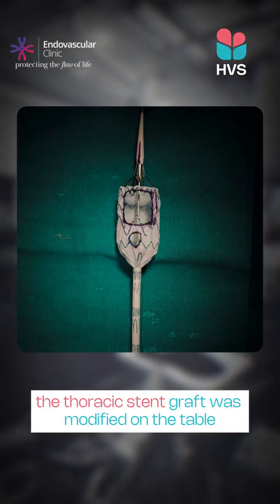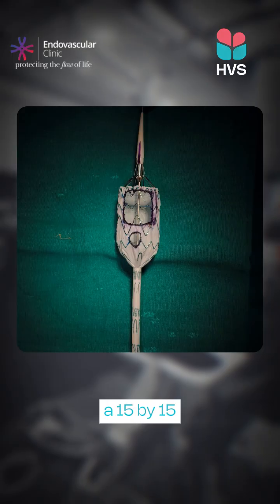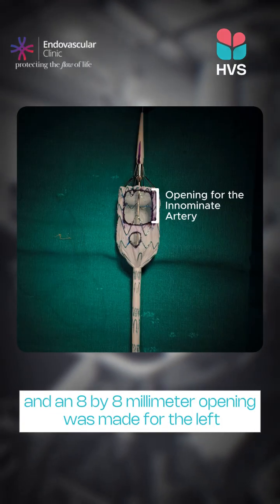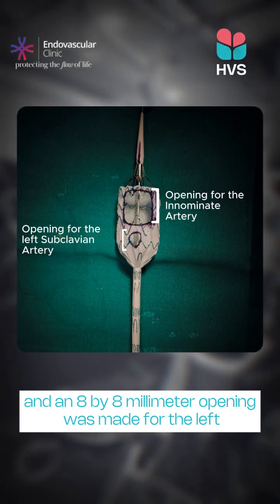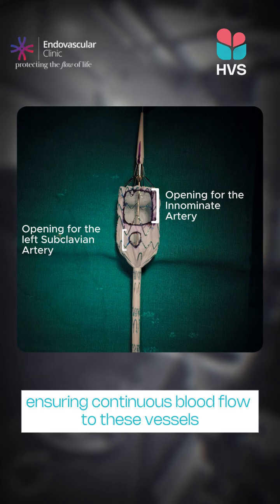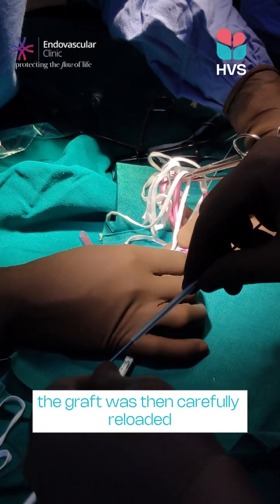The thoracic stent graft was modified on the table. A 15 by 15 mm opening was created for the innominate artery, and an 8 by 8 mm opening was made for the left subclavian artery, ensuring continuous blood flow to these vessels. The graft was then carefully reloaded.